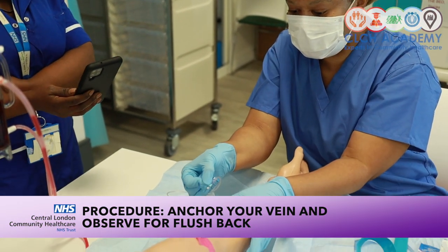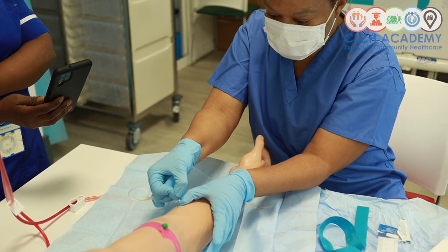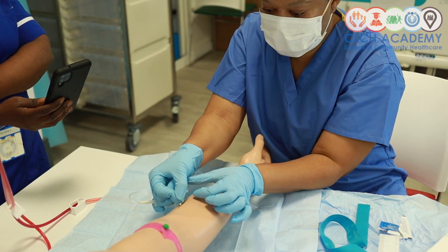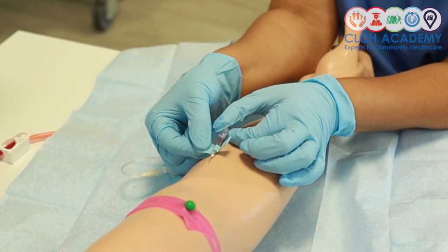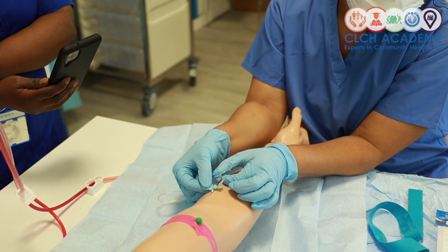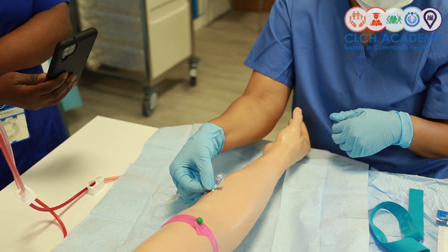Now I'm just going to give myself a little bit of traction to anchor my vein and introduce my needle whilst observing for flashback. And I've got my flashback in the needle. Once you have the flashback, you know that you've accessed the vein. You do not need to advance your needle any further.